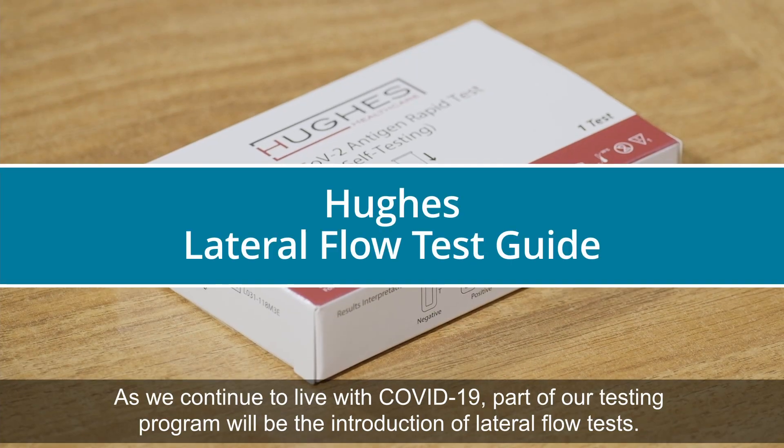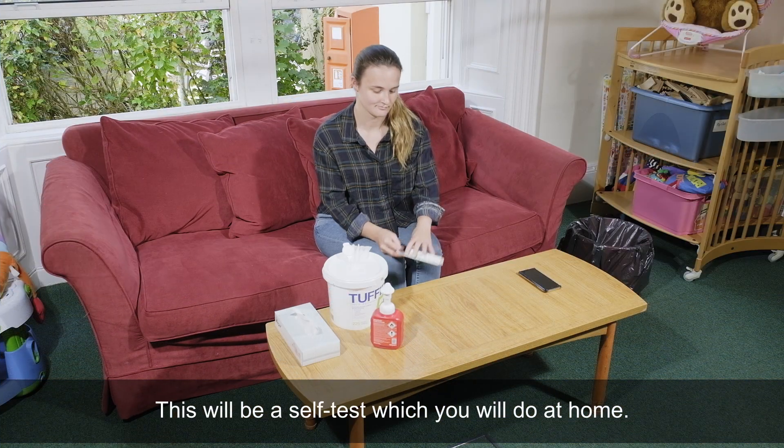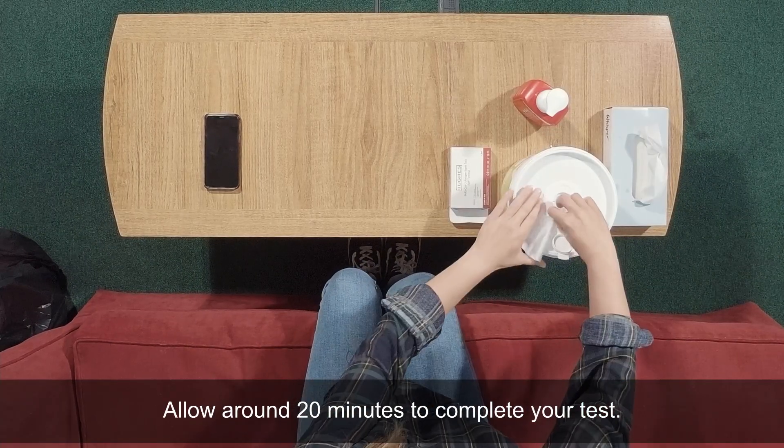As we continue to live with COVID-19, part of our testing programme will be the introduction of lateral flow tests. This will be a self-test which you will do at home. Allow around 20 minutes to complete your test.